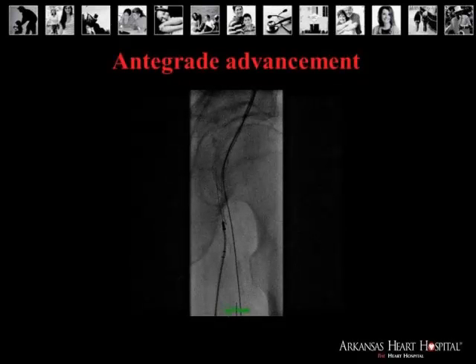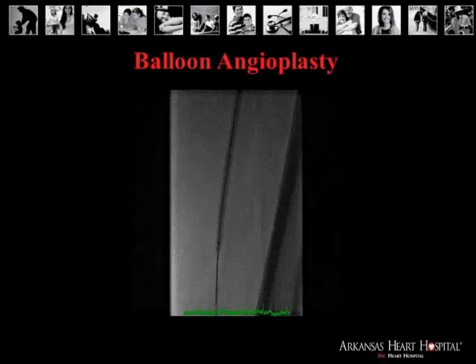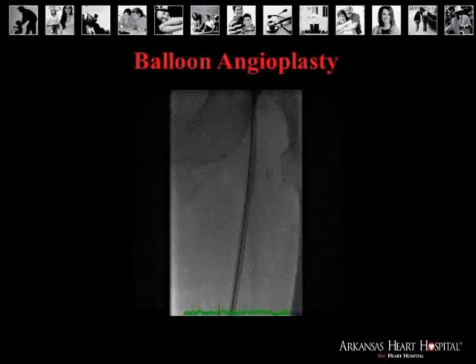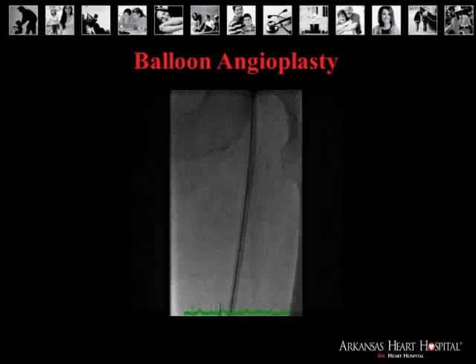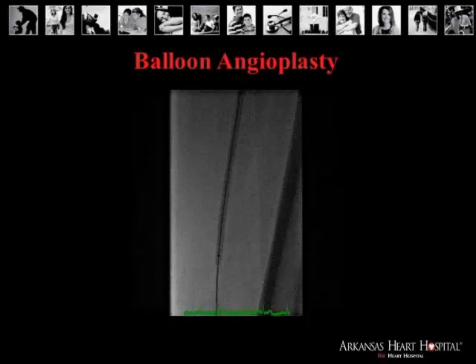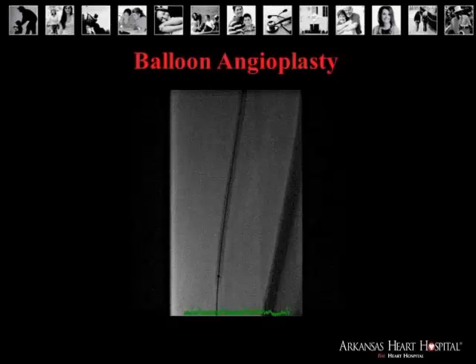At this point, I was able to just pull back the Ocelot catheter and follow it down with the glide wire. Due to the track that the Ocelot catheter had made, the Ocelot catheter makes about a 2 millimeter channel. The glide wire just trailed straight down behind, chasing the Ocelot catheter I was pulling back. I then was able to balloon with a 6x100 balloon, and then I took my Regalia wire from below and was able to advance it up in a retrograde fashion.